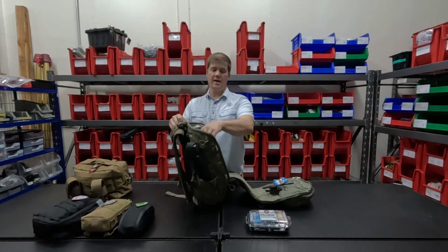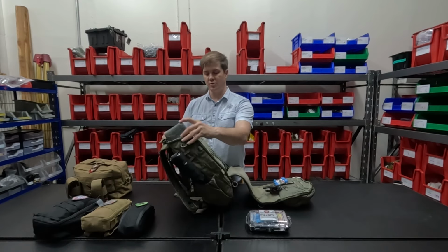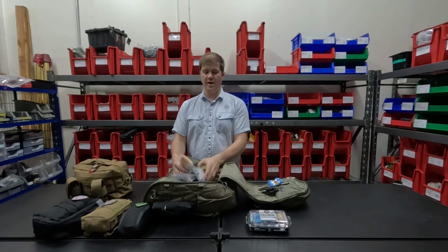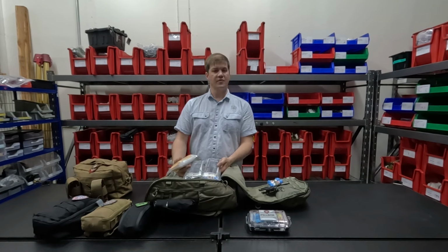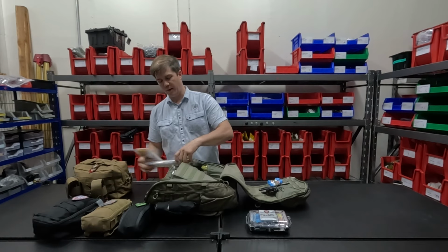You see on one side, we've got some options for ortho injuries if we run into those problems. So we've got 2 SAM splints here. We've got some med mags in the center for us to deploy out. So we've got the hybrid IFAK med mags. So these have a bandage, gauze, or hemostatic, depending on if it's the advanced or basic version. We've got a nasopharyngeal airway. We've got a pair of gloves, and then we've also got a chest seal. So those both live here in the middle of the pack.